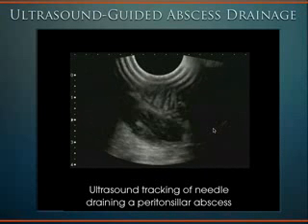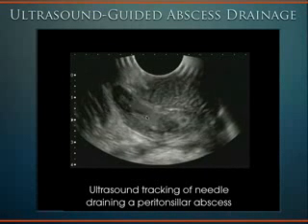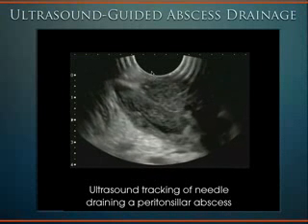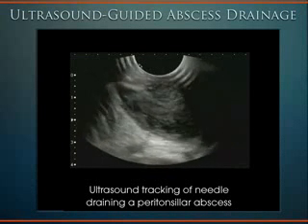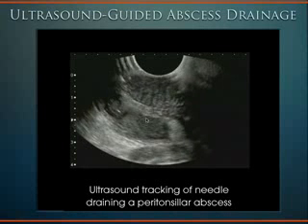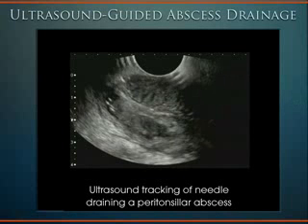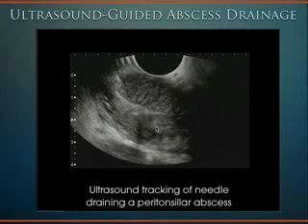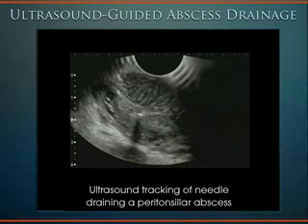You might want to refer some of these more complicated ones to a specialist like an otolaryngologist. But we went for this one ourselves. You're going to see here a needle coming into this abscess, and that's the ultrasound guided. We can see the needle has made its way. You can see the distension of the tissue down here, that needle tracking into the abscess.